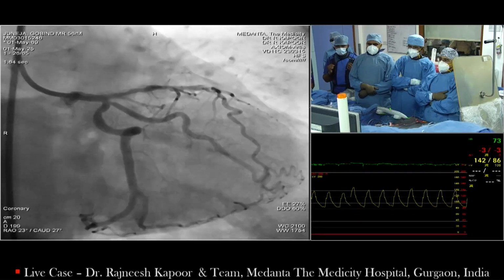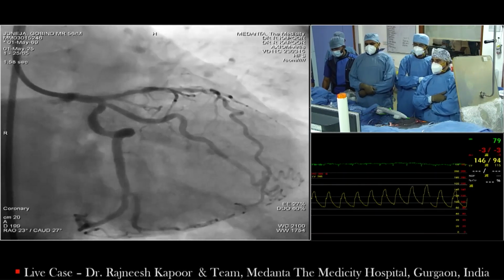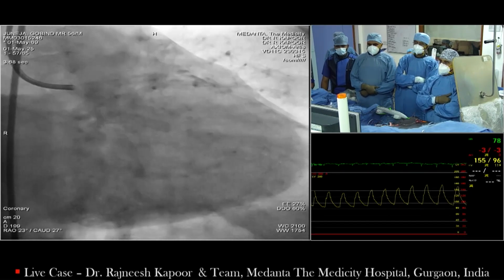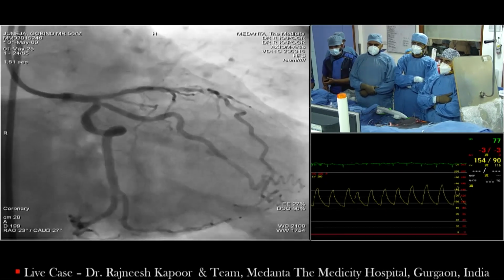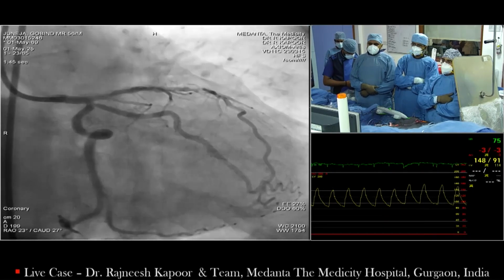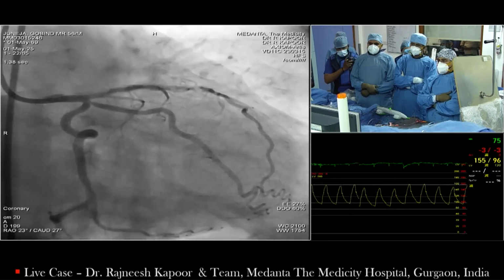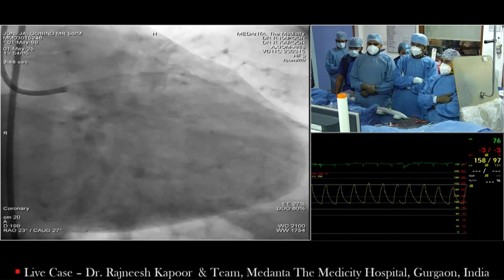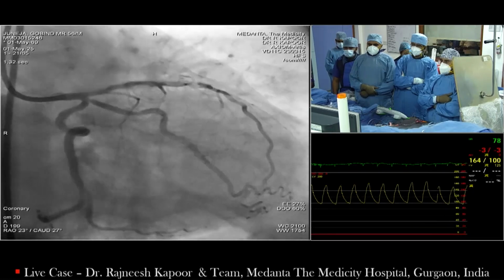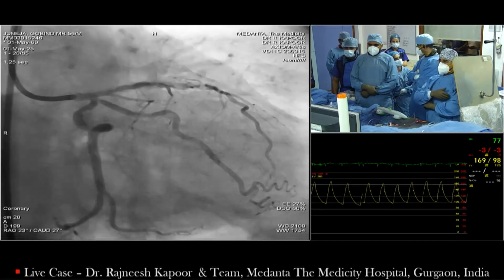Okay, so this is the first shot, and a densely calcified LAD and diffuse disease in the LAD, long segment, and then there is a high obtuse marginal coming from the circumflex, which is also ostially diseased, which is also tight. So acute coronary syndrome, dense long segment LAD calcified lesion, and a tight lesion at the obtuse marginal. AP cranial, next shot.